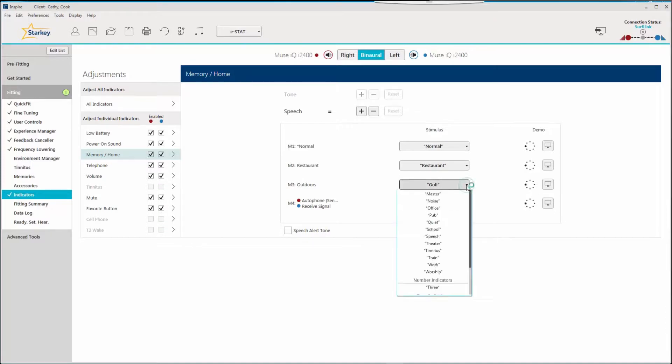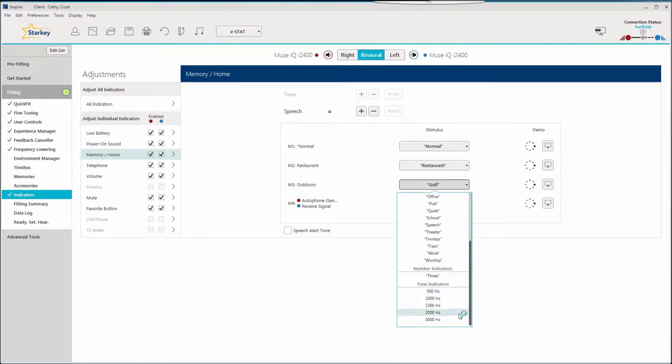If a tone is still the preferred indicator for memory change, set that via this drop-down menu as well.